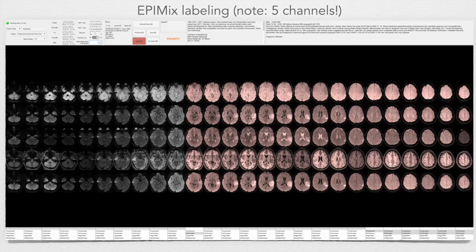And we can also tag them as faint lesion. We can tag them with degenerative white matter, metal artifact. We can exclude them. The button up there is for saying this patient is acute. So this is sort of how we have gone about labeling the data.